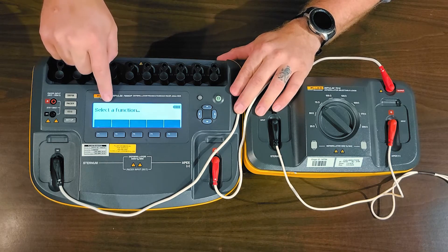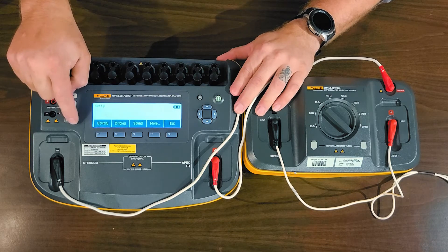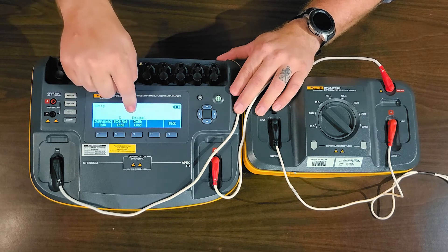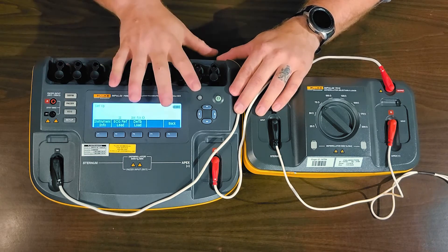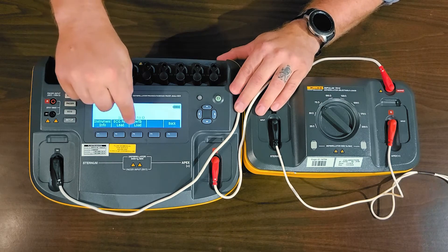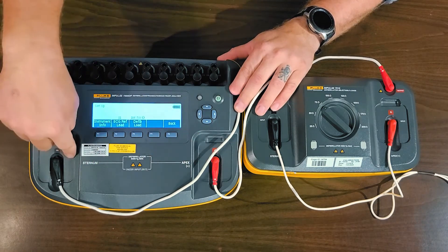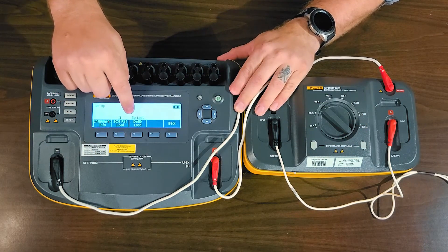It says Select a Function. So prior to using this, I need to go into Setup and then F4 for more. It says Defib Load above F3. It has two options: External Load or Internal 50 Ohm. Yours is probably set at Internal 50 Ohm unless you've already used your 7010 loadbox. To use the 7010, we have to push this and it should now say External Load.